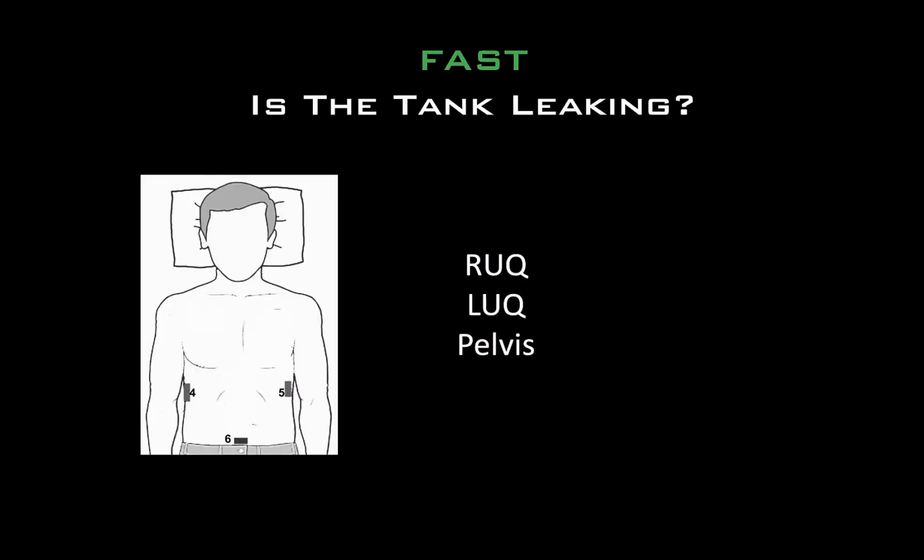The next question with respect to the tank will be to determine if it's leaking intra-abdominally, and this is where the FAST exam comes in. This consists of 3 views: the right upper quadrant, the left upper quadrant, and the pelvis views. And what I will emphasize is that these views can yield invaluable info about medical patients as well as trauma patients, if used in the right clinical context.